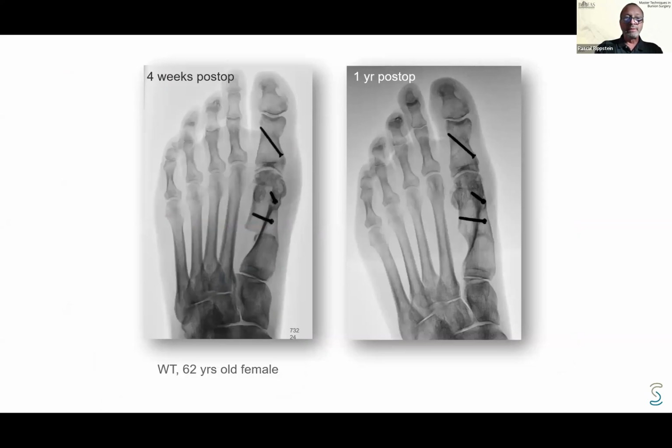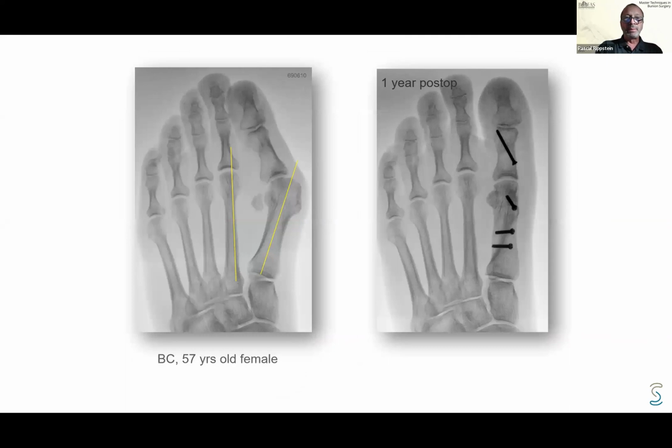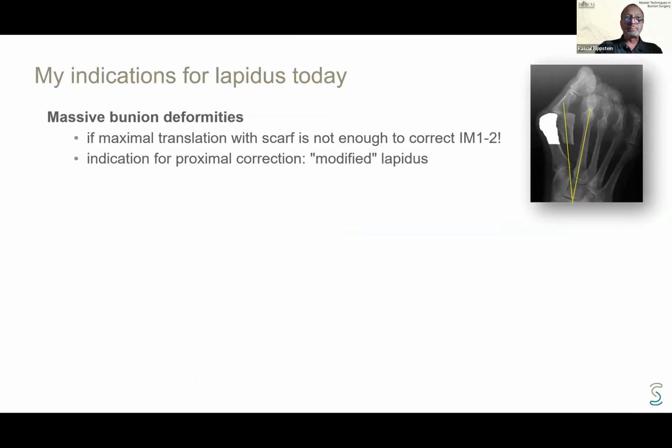These are a couple of cases. Here again, a maximal translation, 3 point of fixation, distal, cortex, and Z-shaped proximal. Again, here one maximal translation. And all these cases are healing because they're stable enough. Here, even bigger deformity, again, with healing. So actually with the scarf, I realized I can also deal with severe deformity.